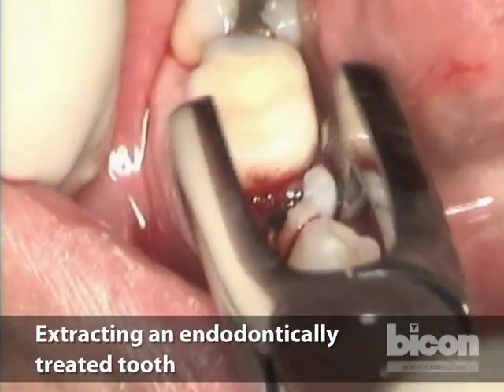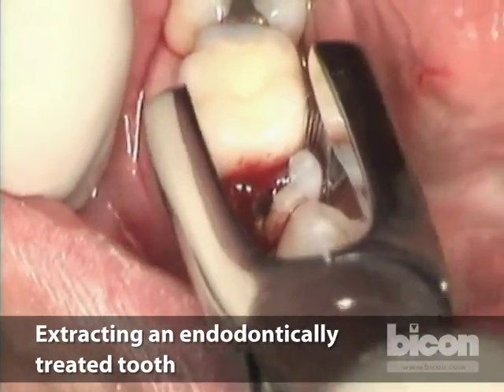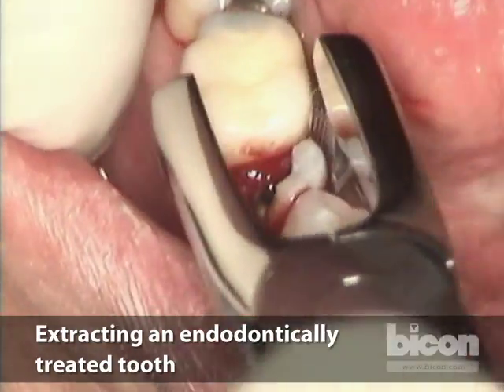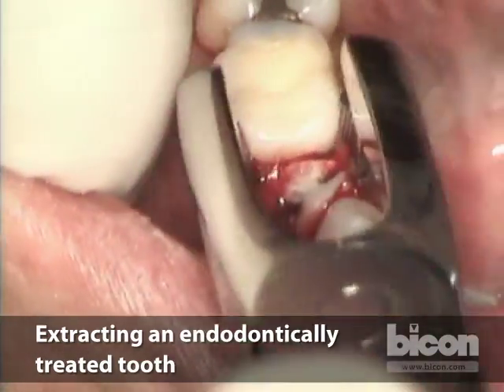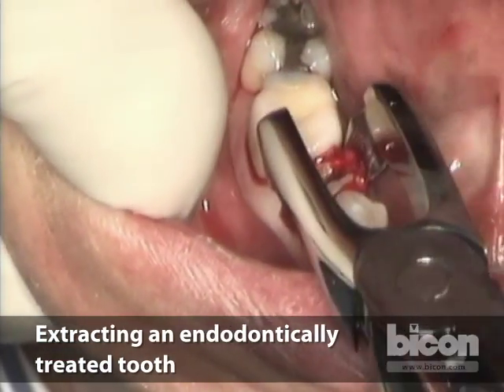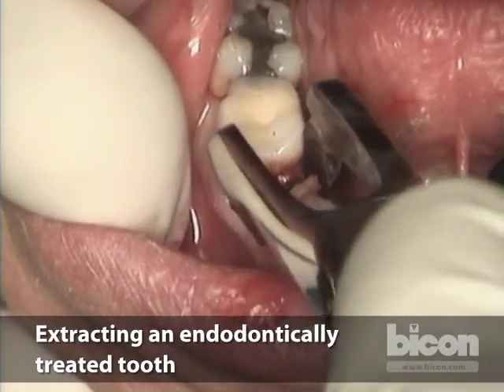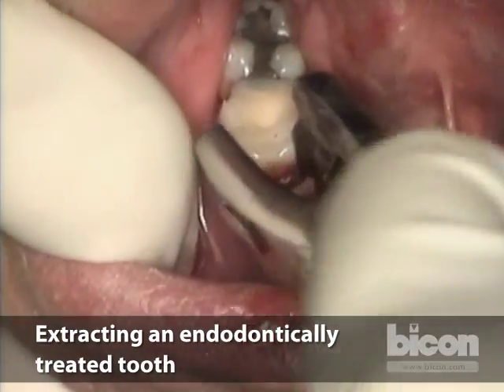We use specialized forceps that don't close completely. They have thin vertical serrations inside that give us the ability to torque the root if we can slide down and grab it. The idea is to be as careful and deliberate as possible — the slight movement initially will start severing more and more periodontal ligament fibers until the tooth is fully mobilized and separated from the bone, no matter how thin the bone is. The best way to atraumatically remove a tooth is with appropriate forceps. Elevation always sacrifices or crushes bone; forceps can hold the tooth and slowly deliver it.